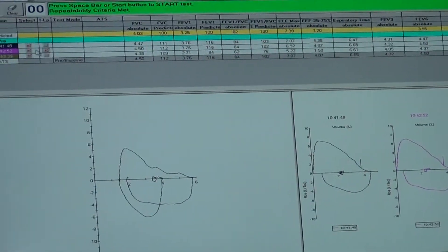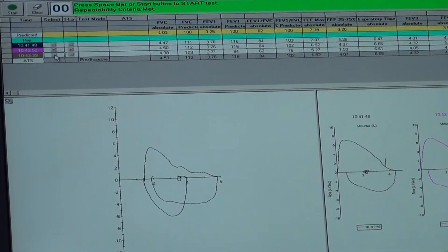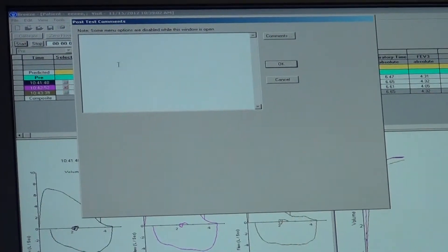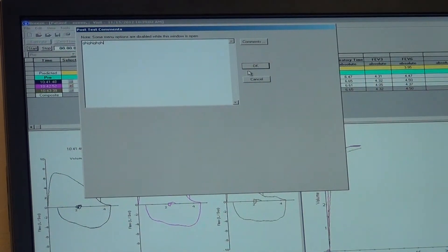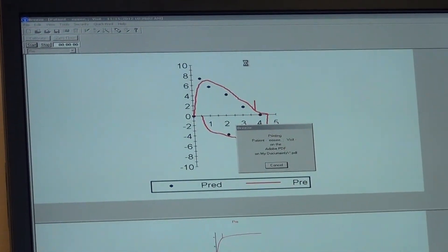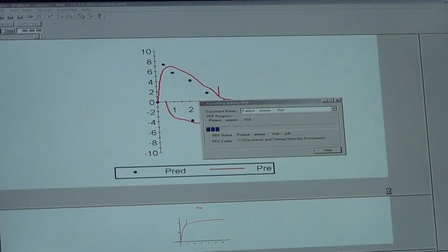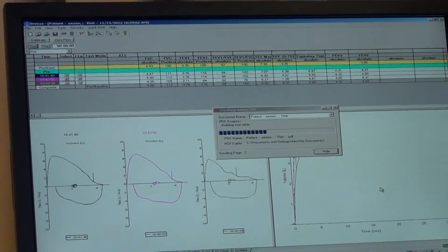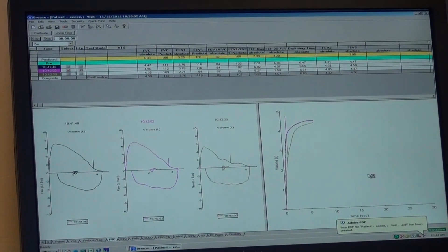Make sure attempt number two is clicked, then uncheck the boxes for attempts one and three. Then go to the Quick Print option and select FVC. You can add comments here — we usually put the sitting posture or any other relevant note. Now save your file and it will be saved as a PDF.